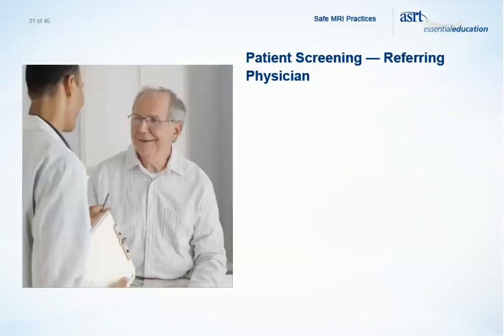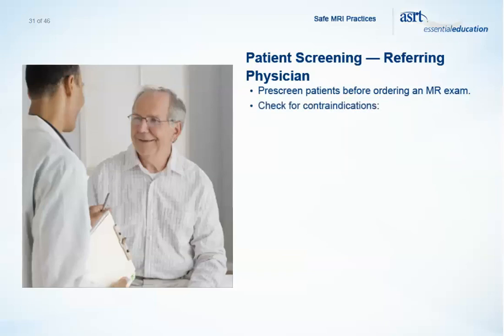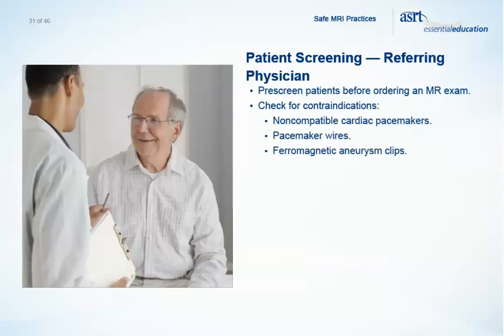The referring physician should pre-screen the patient before ordering the MR examination. The physician should check for factors that might contraindicate the examination, such as non-compatible cardiac pacemakers, pacemaker wires, or ferromagnetic aneurysm clips. Pre-screening also should include verifying that the patient's size and weight do not exceed MR table specifications.